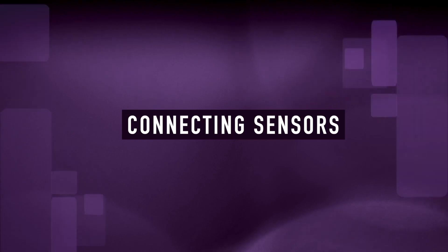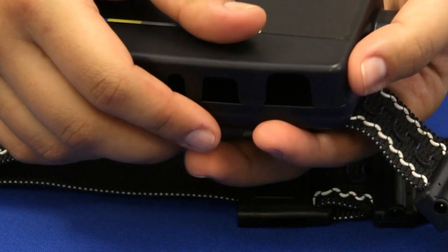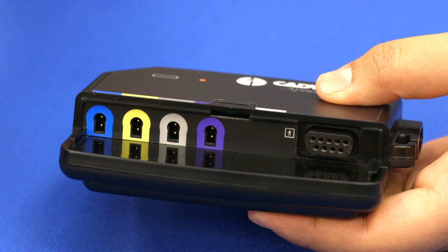If your provider has already sized the belts and connected them to the device, skip to the chapter 'Wearing Your Apnea Track.' To remove the port cover, press on the arrow and slide the panel down. The sensors are color coded to match the connection ports on the apnea track.